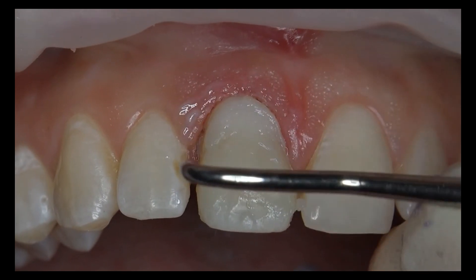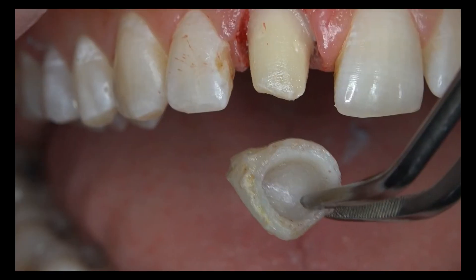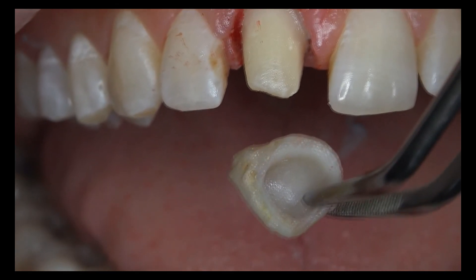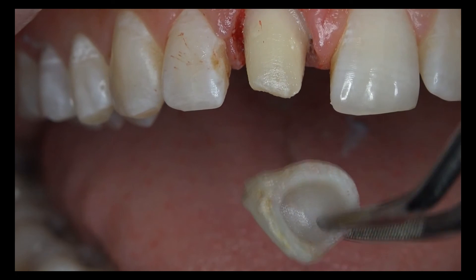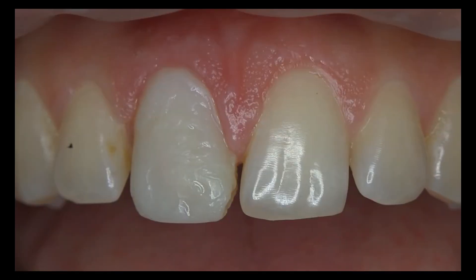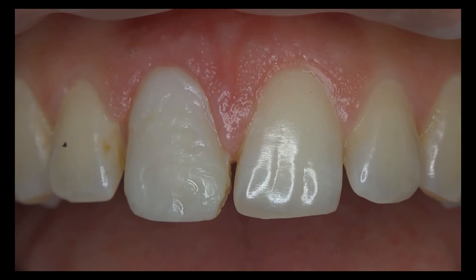We locate the papilla region to prevent black triangle at the proximal contact — we have discussed this subject in detail in our previous videos. We remove and control the temporary crown after setting is complete and finely polish the gingival part if no improper margin line is present.